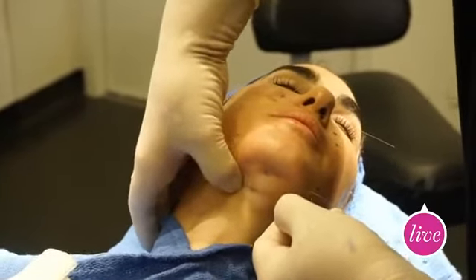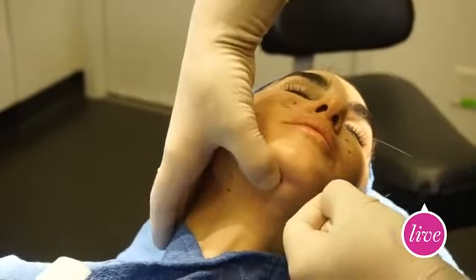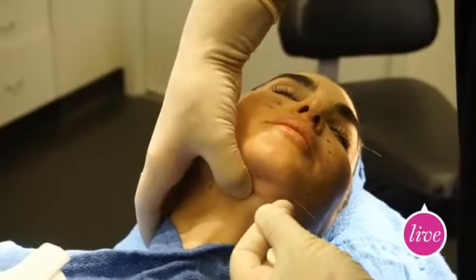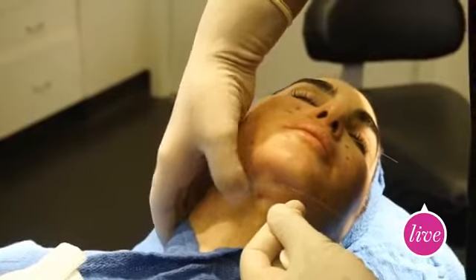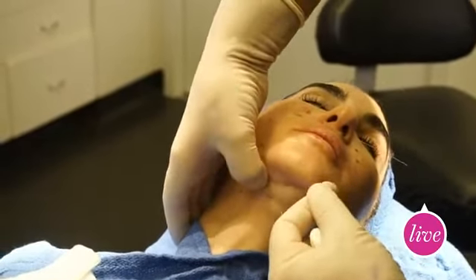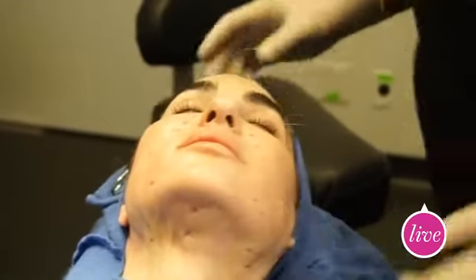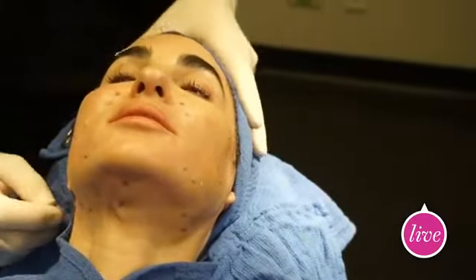Now that's very rare. I've used Silhouette on an 86-year-old patient who was not a surgical candidate because she had health issues, where she just would not tolerate anesthesia. And I did Silhouette in the neck and in the mid-face, and she got a fantastic result, even though she's very thin-skinned. We were able to put it in the right plane, and she did great. But look at all the advancement of the tissue that I have. Wow. Let's just straighten it. So are you ever too old or too young to get this procedure done? I don't think so. I think it has to be assessed on an individual basis.